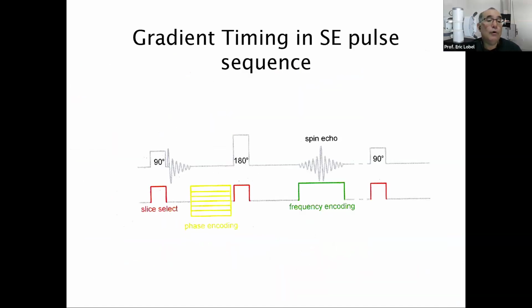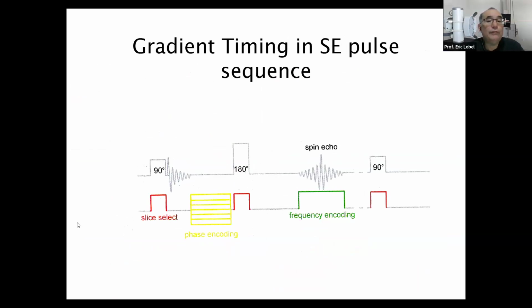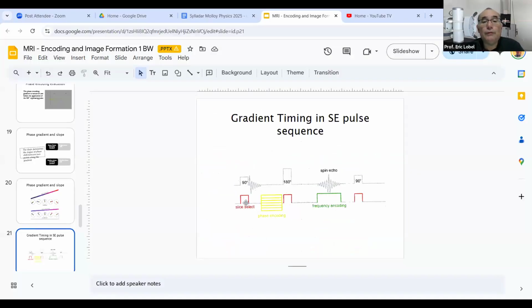So this is an overall timing of events that we just went over. We start with the slice, we get an FID, phase encoding, we put some information into K-space, rephase. Again, this is a spin echo sequence, but generally for gradient sequences, it's the same process. The only difference really, well, there are others, but one major difference is the slice selection gradient is only activated during the excitation pulse.